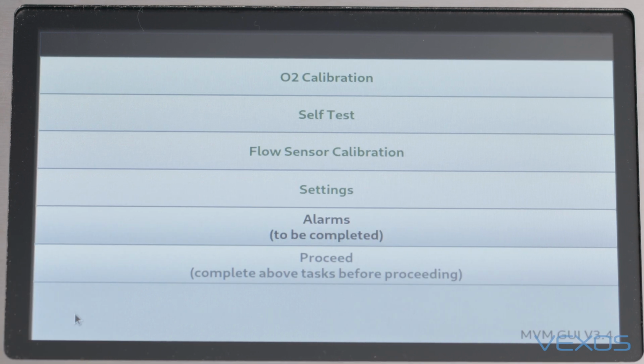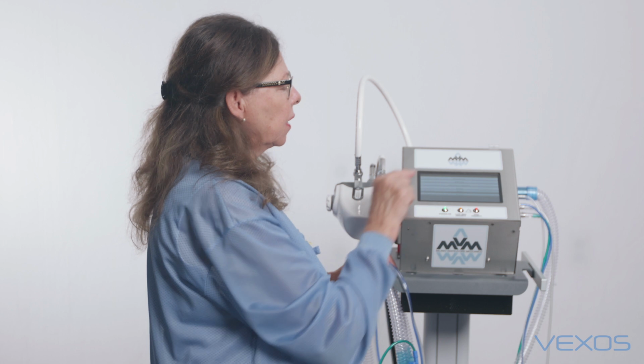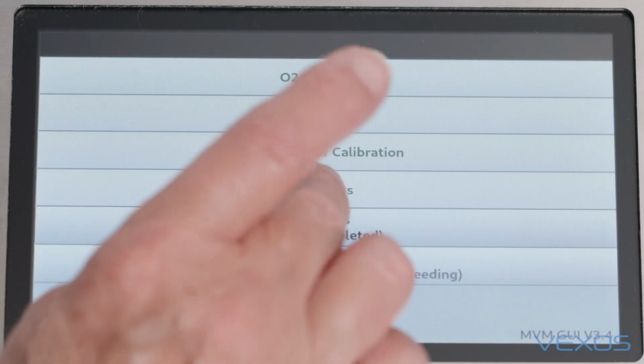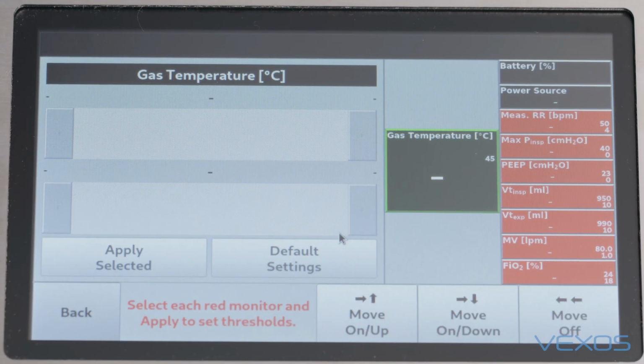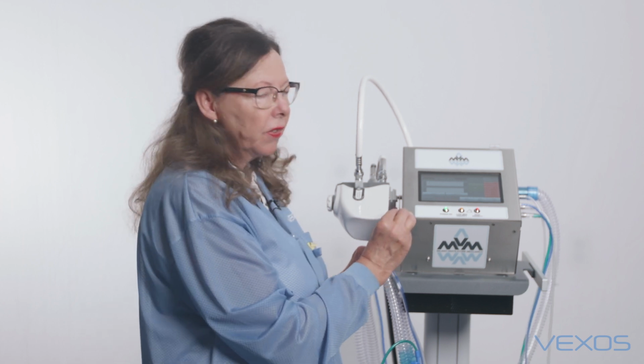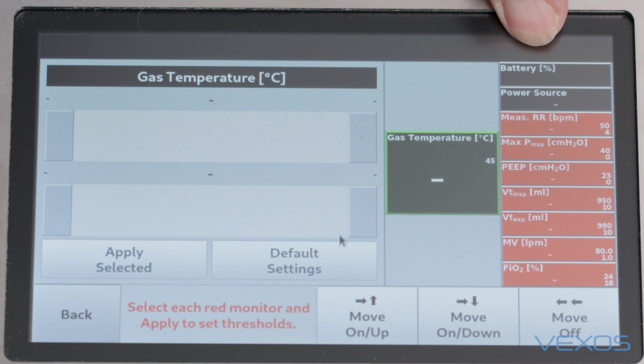Pressing the back will bring me back to the startup screens. Settings has now been greened. It's done. One more to do, and that is the alarms. I need to review the alarms before I set the patient on this ventilator. In a sense, these are broad and safe alarms. I can fine-tune those alarms once my patient is attached. And you have all of the various alarms.